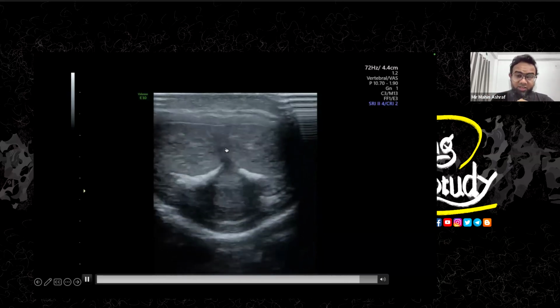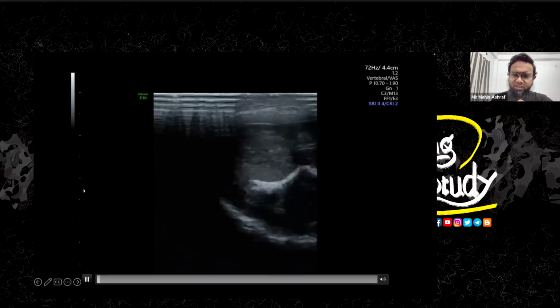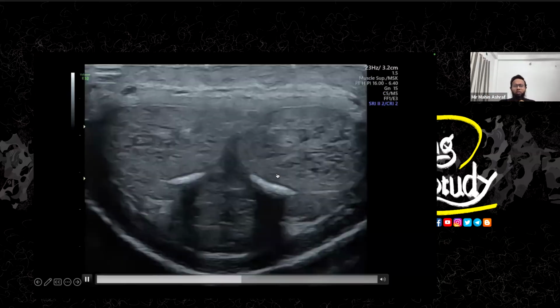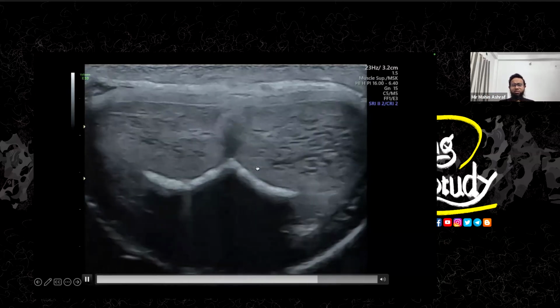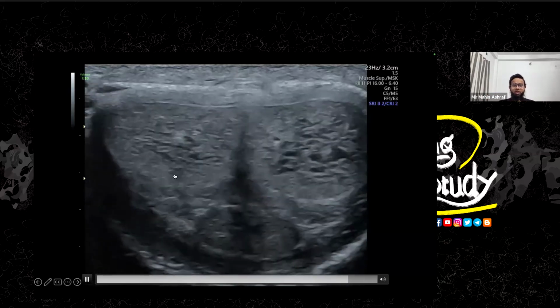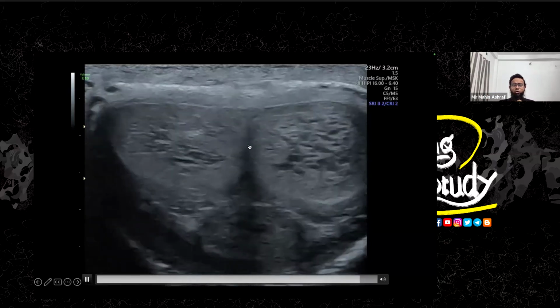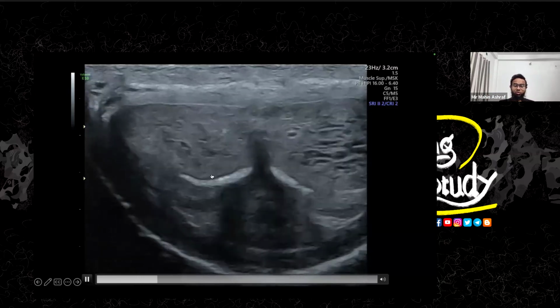So they're large in number. So it's not a good condition. Actually, the prognosis, I think, is not very good. So here, after some manual massage, you can see the penis is slightly erected, but the patient was feeling pain, and you can see these plaques quite well right now in between two corpora cavernosa and corpora spongiosum also.